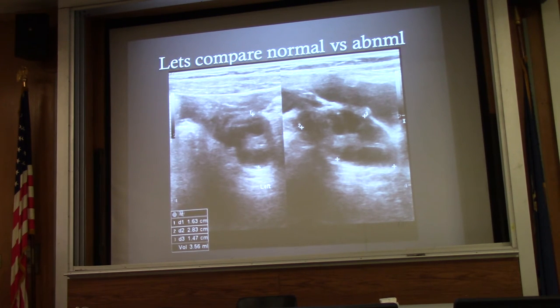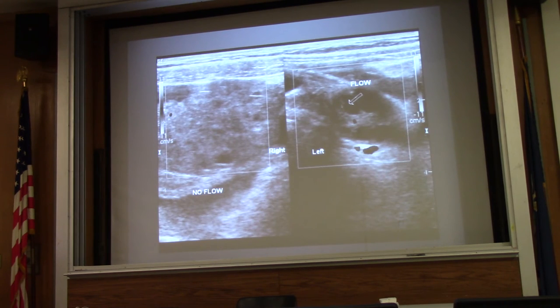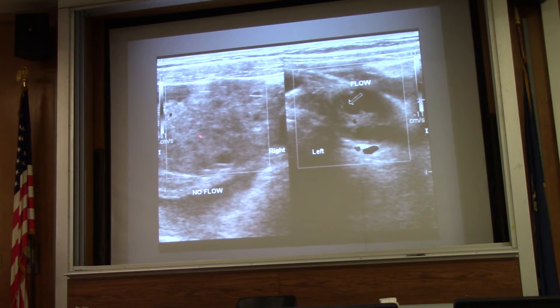Comparing both sides side by side, on the right side you have this large ovary. Applying color Doppler looking for flow, there is no flow on the right side compared to the left side, where you can see central flow. The most common mistake is looking for flow only in the periphery — you want to look for flow within the central parenchyma. This patient had torsion on the right side.